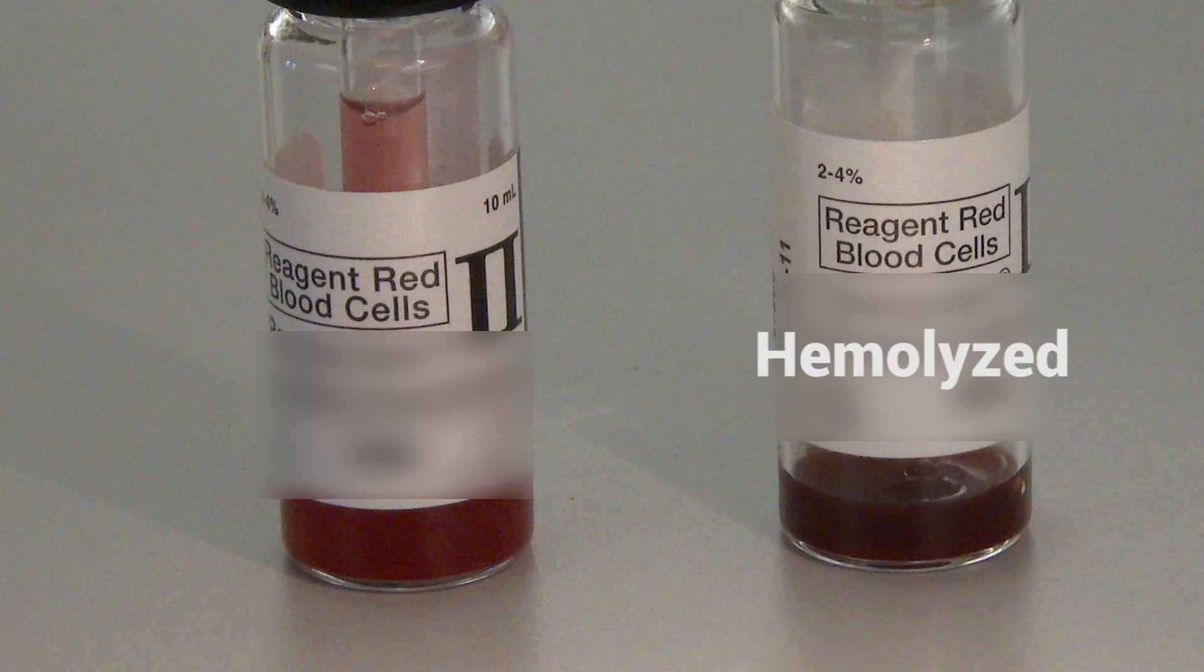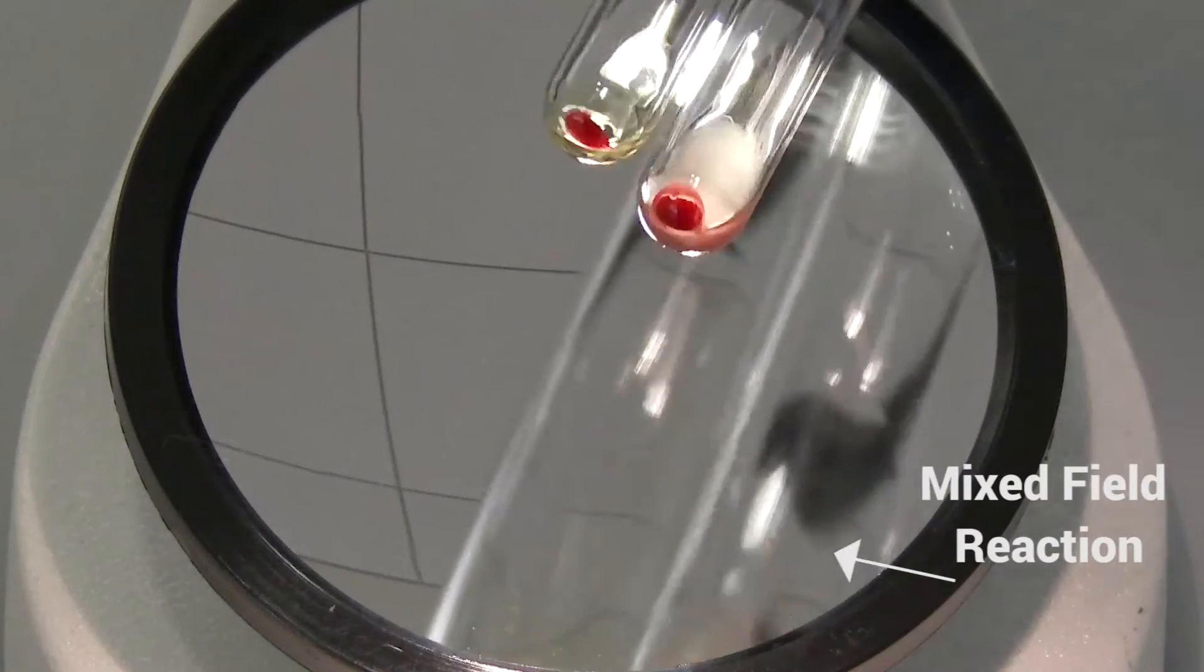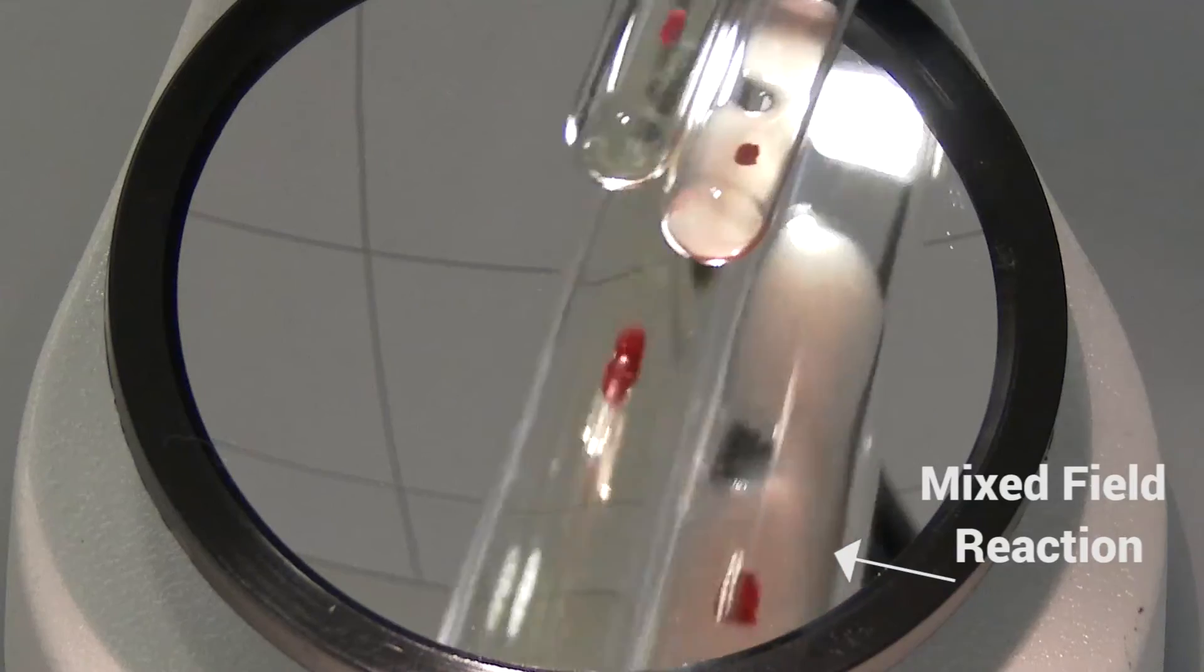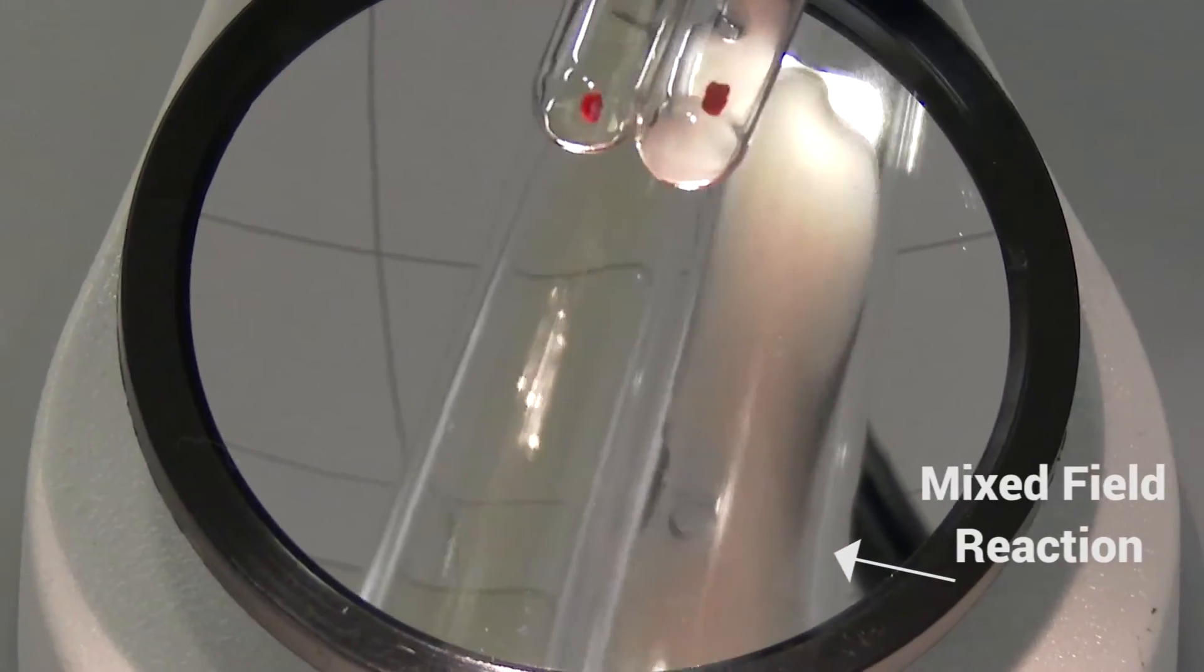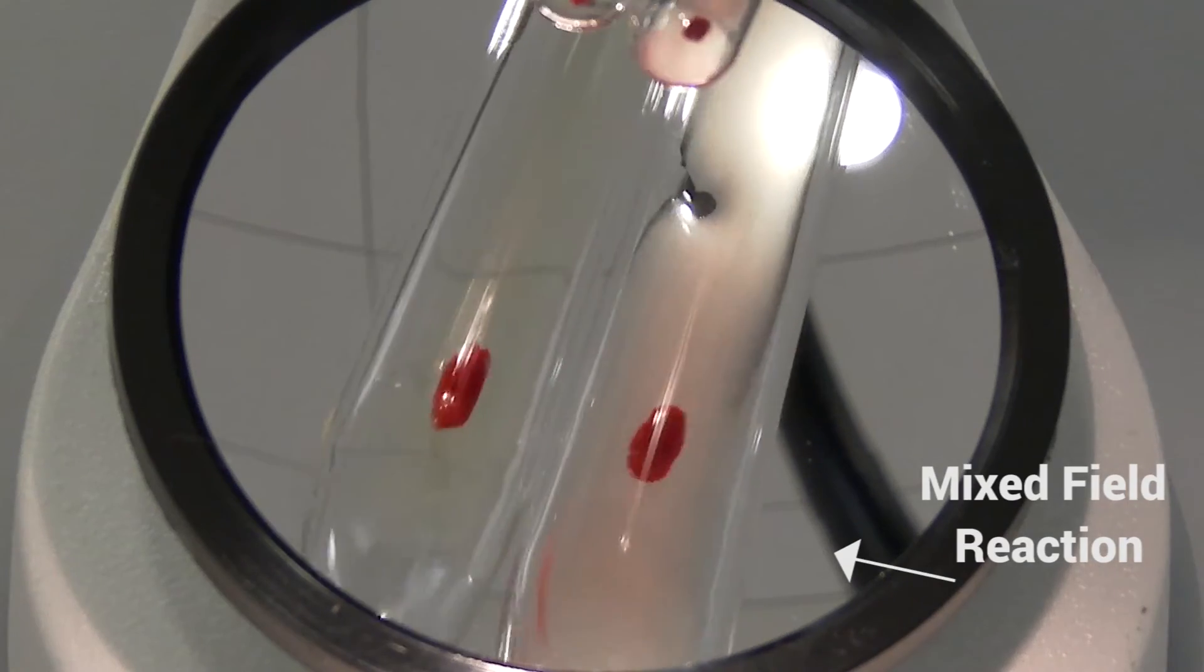The presence of large, strong agglutinates against a backdrop of free-floating cells is an indication of a mixed-field reaction. Such reactions are incredibly important to notice because they are abnormal and the underlying cause should be identified.